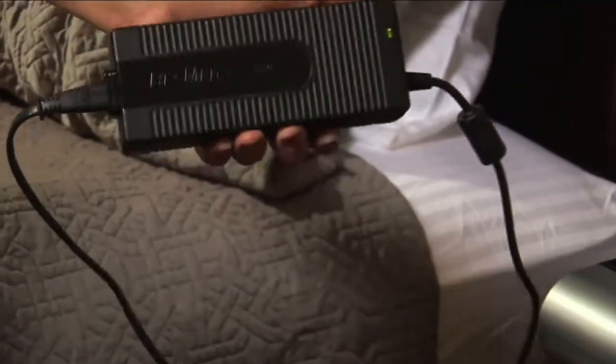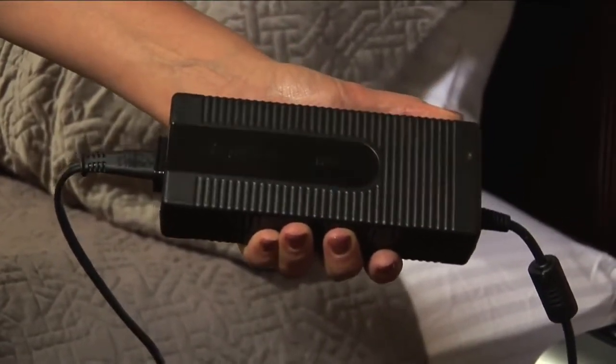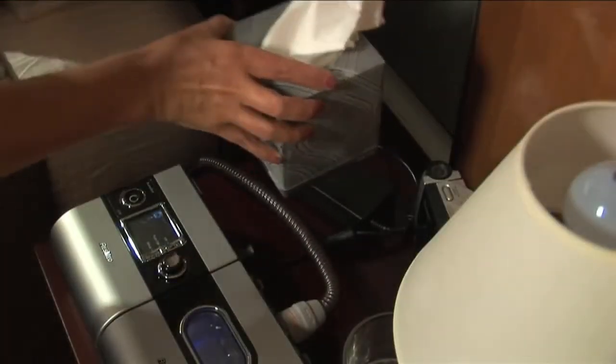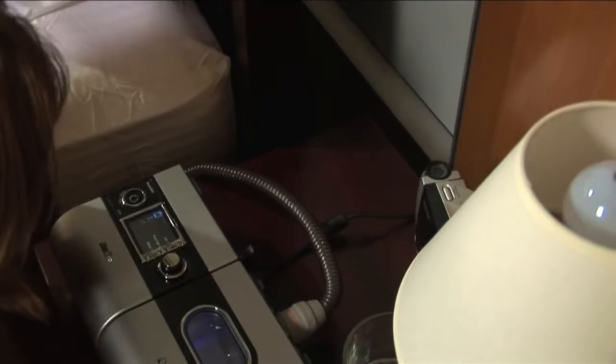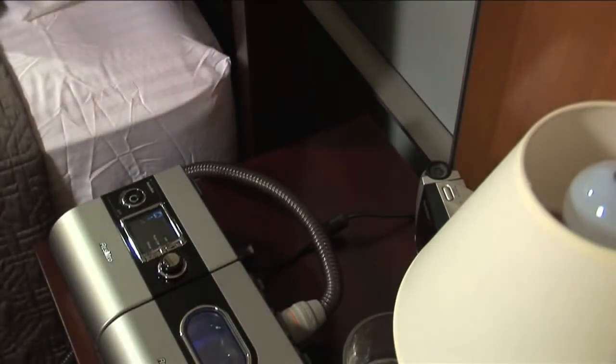Many CPAP devices have power adapters. These adapters look like small bricks and typically generate heat. To avoid overheating, we recommend you keep the power adapter out in the open and away from the device, where it can properly ventilate. Having the power adapter too close to the device may cause false room temperature readings, which may affect the humidity level of your therapy.